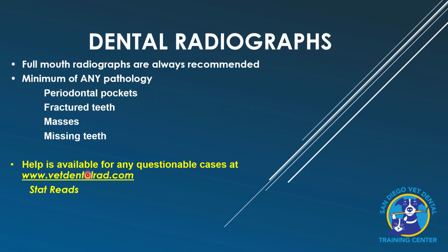I can't stress this enough. Yes, I know, my clients don't want to pay for x-rays or whatever. Yeah, you've got to take x-rays. There are numerous studies, study after study, that show how critical x-rays are. Dr. Verstraete's study talked about the value of full mouth x-rays in dogs and cats. You've got to do it.